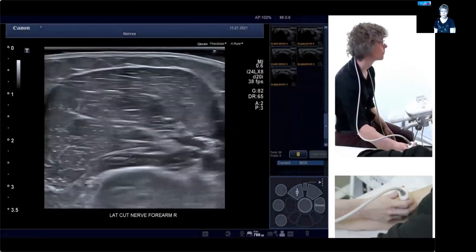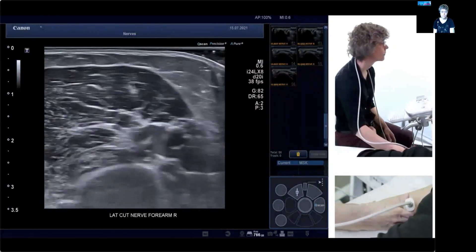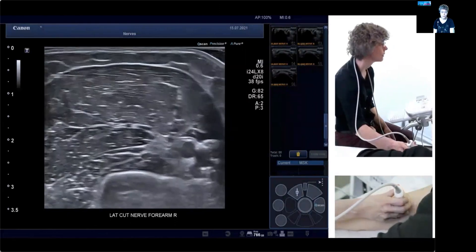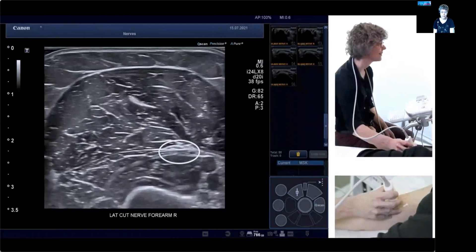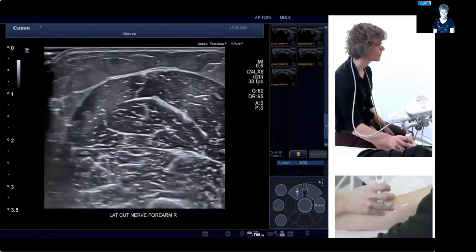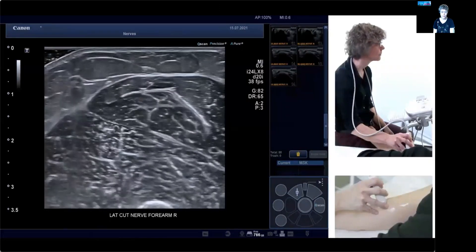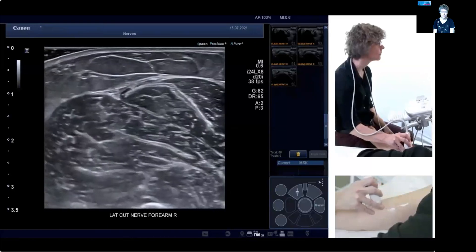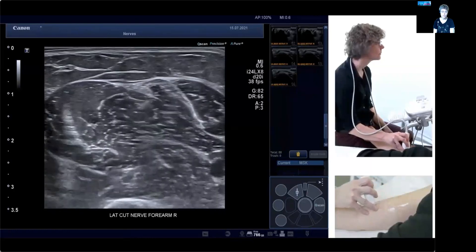Now let's do the scan demo. We start in the upper arm, sort of mid-upper arm, where you can see the brachial artery and the nerve branching out in the biceps brachii. The main branch highlighted here will be the cutaneous nerve of the lateral forearm. When we go distal scanning, you can see it running between the fascia linings of biceps and brachialis. Remember, brachialis is the muscle on the humerus that becomes quite big when you go distal.